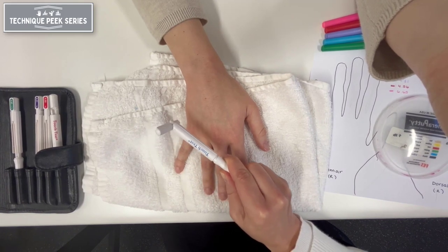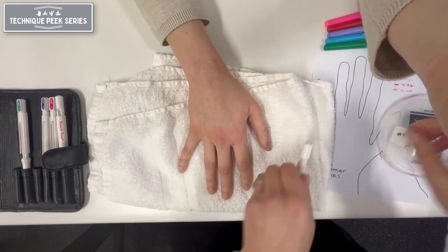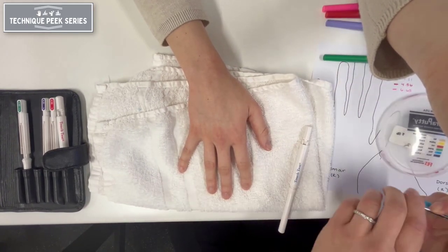When the patient indicates a response, record the result using the colored pen or pencil that corresponds to the color on the monofilament handle.